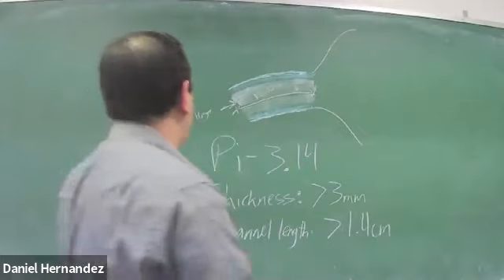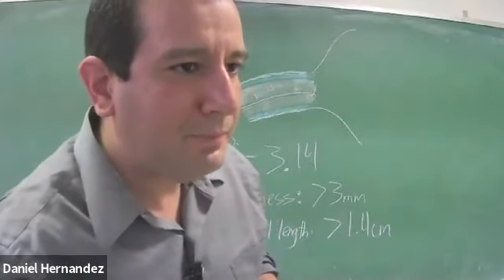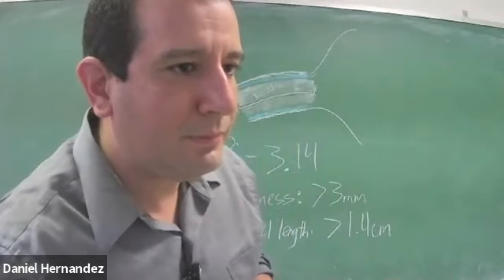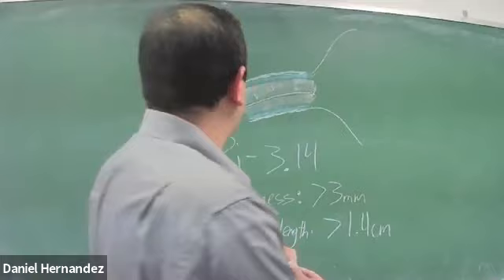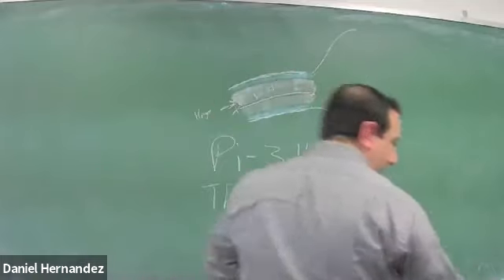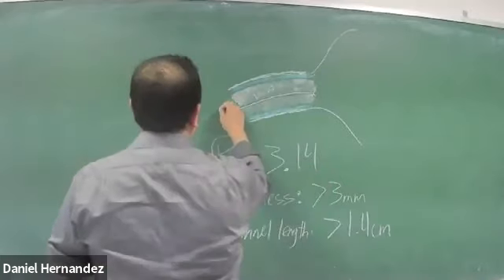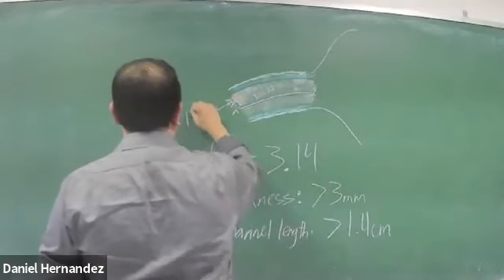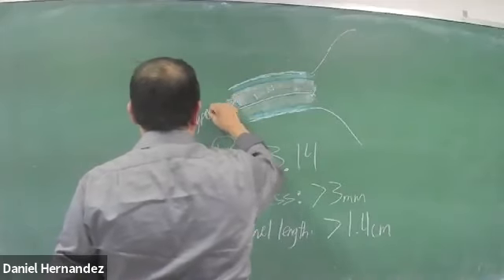I apologize. I did this kind of backwards. So this is, I'm sorry, hypoechoic.